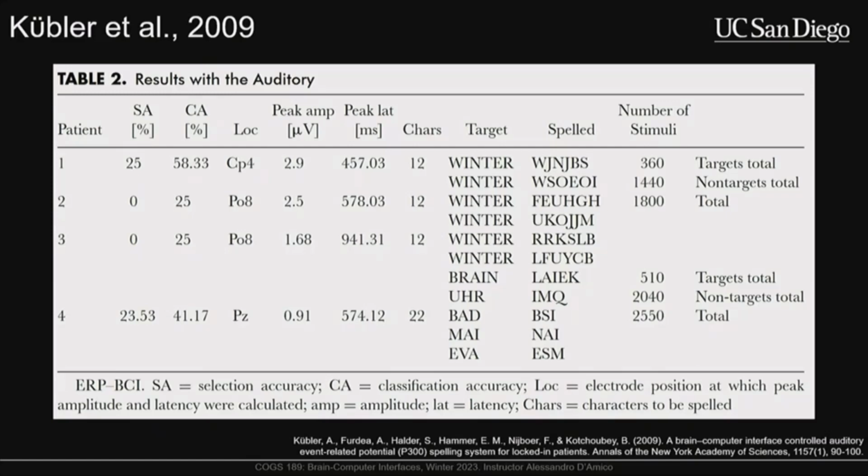In my case, I used a very extensive corpus, and really what you want to do is use a very restricted corpus. Especially when you're designing a system for somebody who's in a state like this, you don't need every possible word to be something they can spell. It just needs to be pretty simple.